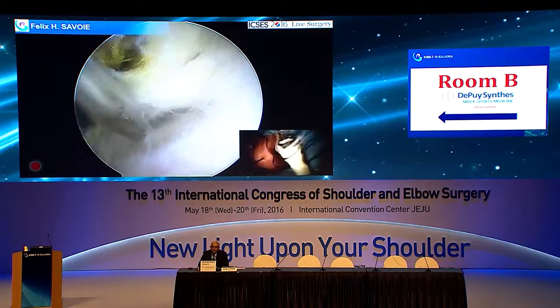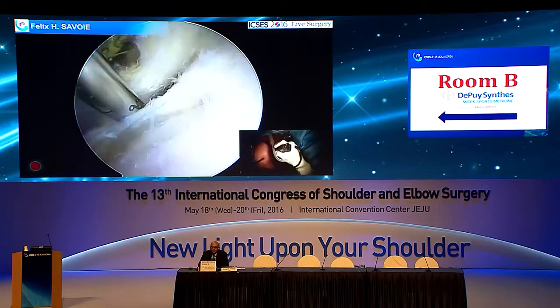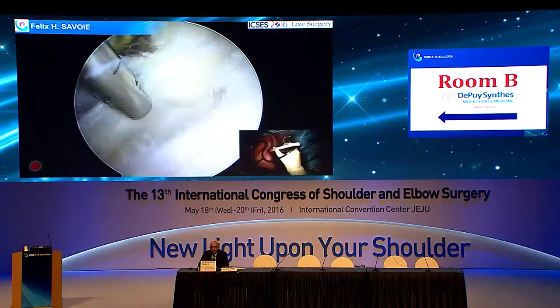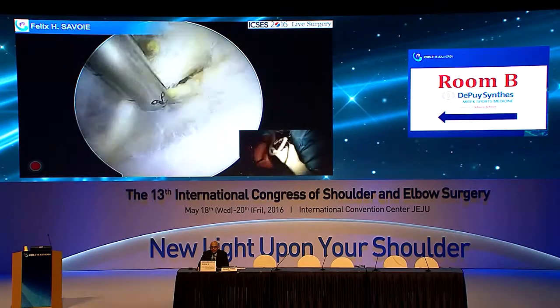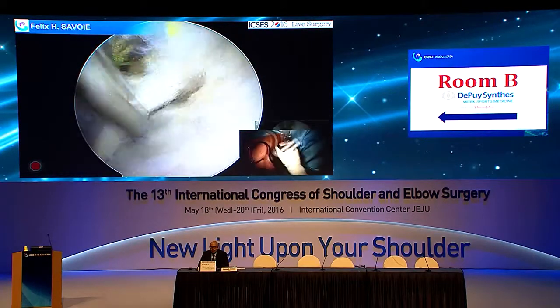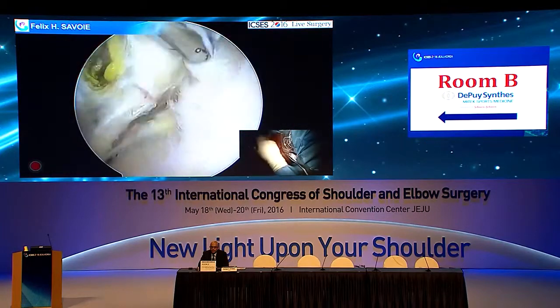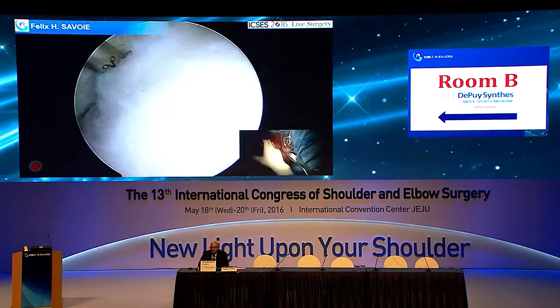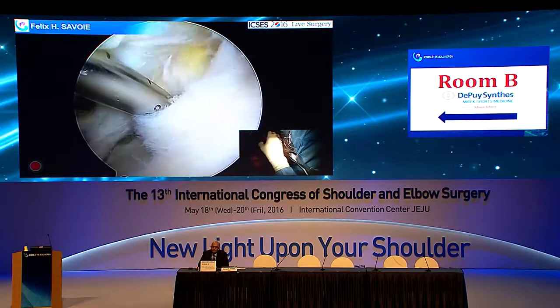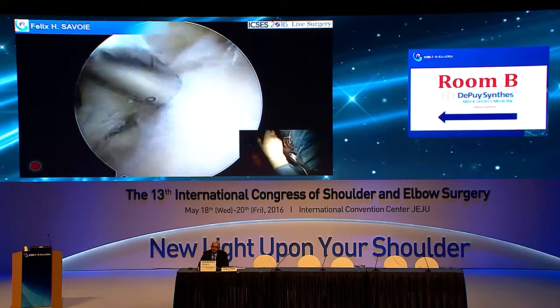Here is the conjoint tendon. People do get partial tears in that, especially gymnasts, and it's a nice way to fix it. And if you like Steve O'Brien's way of moving the biceps to here, you can do that. But that looks pretty good. The second thing is to check for a coracoid spur. We really don't see much going on there. And we can move over a little bit now and come more medial and clean this off, and we'll get right into the coracohumeral ligament.